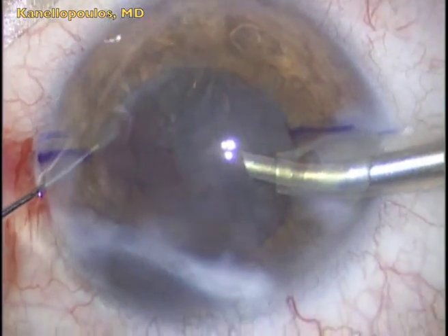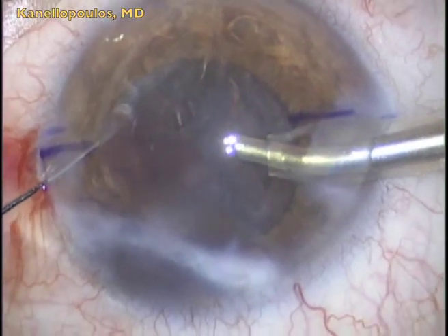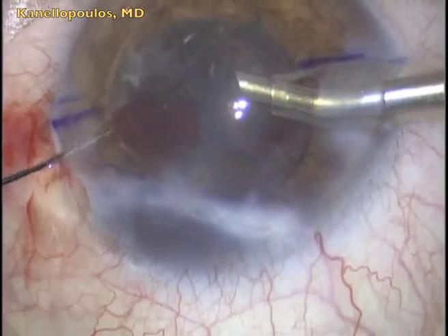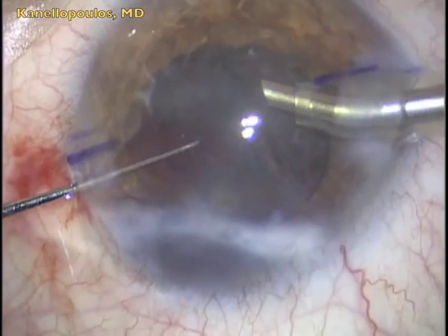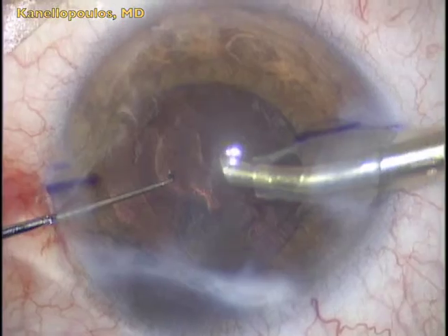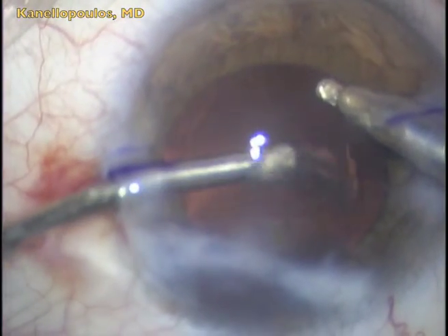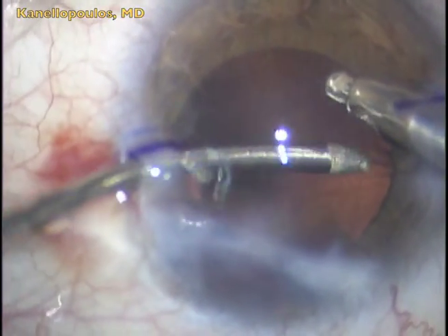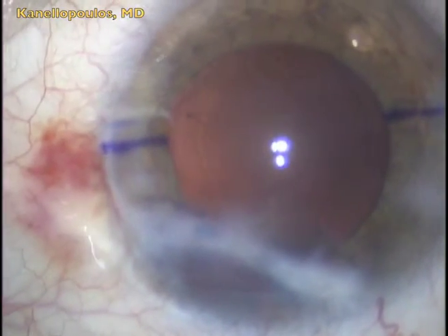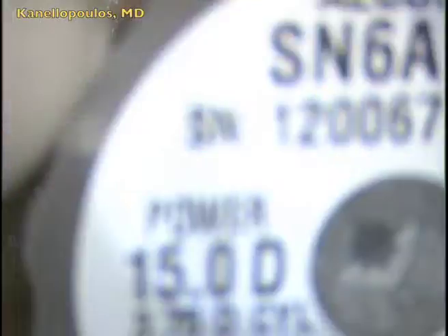After hydrodissection, the lens, as you can see here on a 57-year-old gentleman, is not quite hard. It's quite easy to remove. It's mostly cortical changes. We will remove with high aspiration here the last remnants of the lens, and with the split irrigation aspiration we'll go in and remove the residual cortex, polish the underside of the anterior capsule.